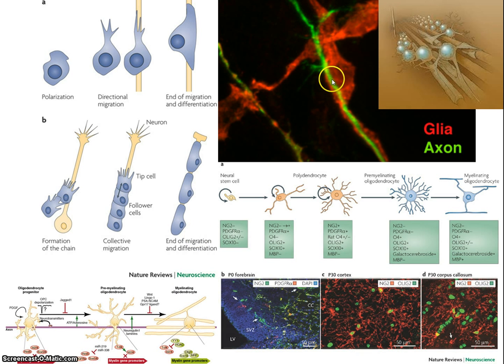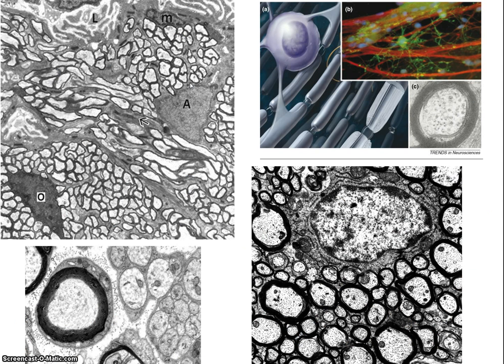So this is not a myelinated axon here. They're not seeming to illustrate it there. So are they unmyelinated fibers that the cells are grabbing onto and migrating away from the primary tumor? So here on the bottom right, this is an oligo. It's actually a mature oligo in here, but we're trying to picture an early oligo.